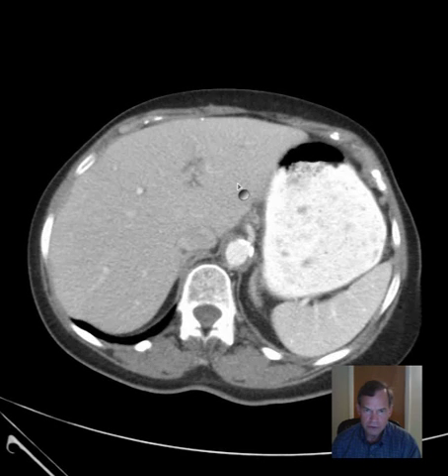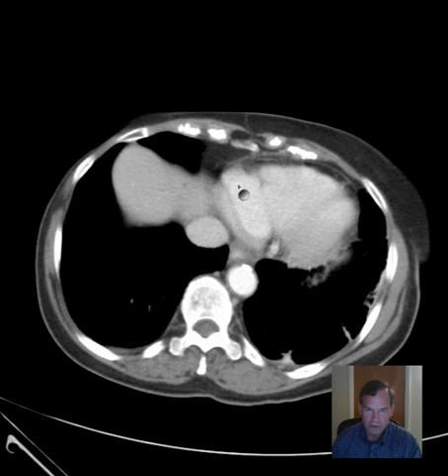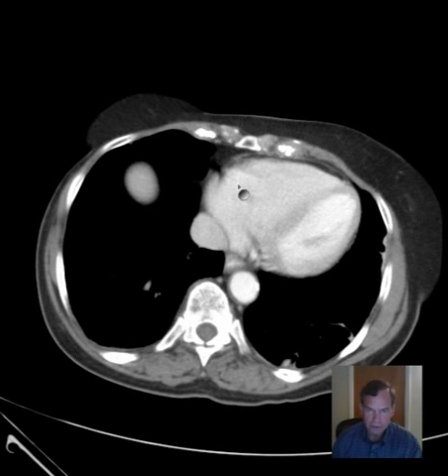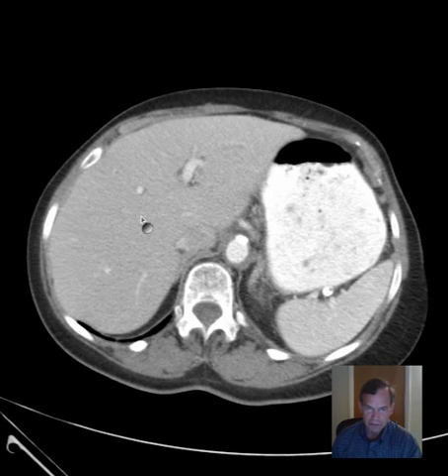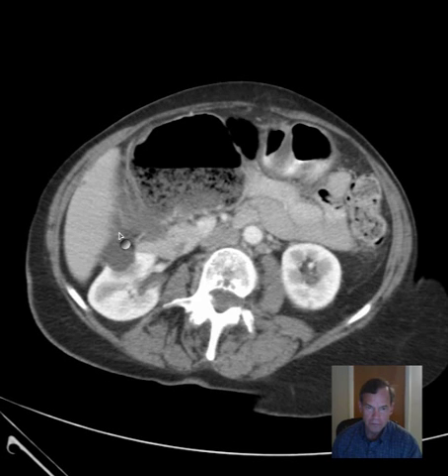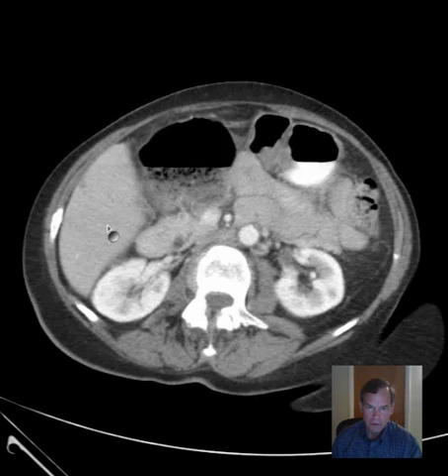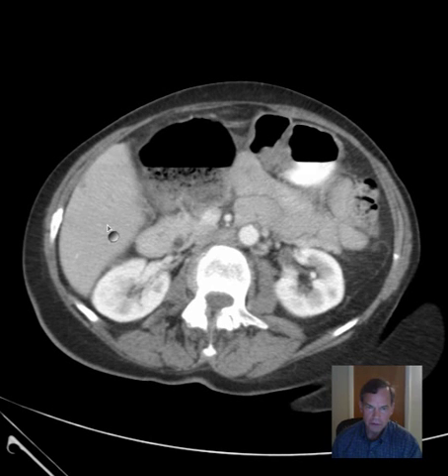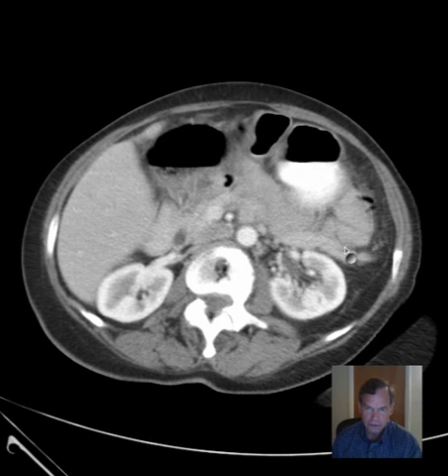First, let's make sure we cover all of our ground and comment on the liver. It appears unremarkable, although there's probably a little tiny cyst there. The liver otherwise appears okay.